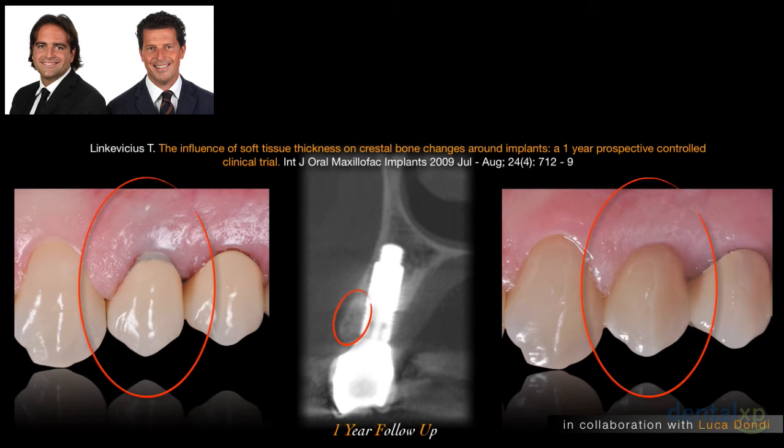And you can see not only that, but also the peculiar shape of the final restoration, the subgingival contour, the critical contour, the subcritical contour, how the trabecular metal implant is working well inside the bone of our patient, and how everything, white and pink aesthetics, are blending together to the success of our final restoration.